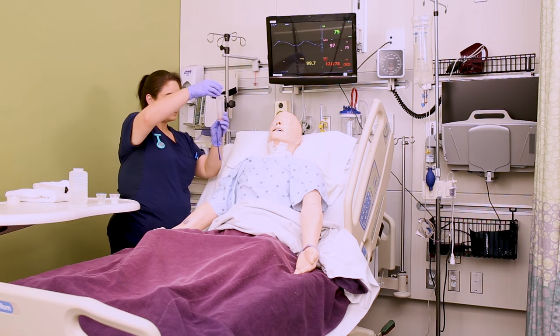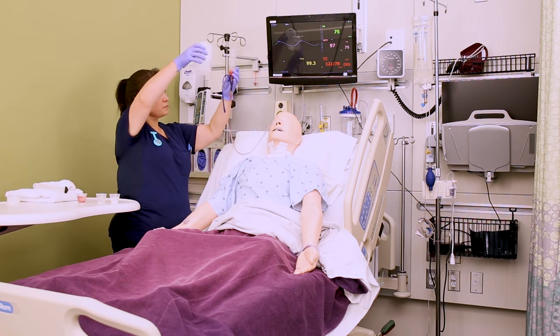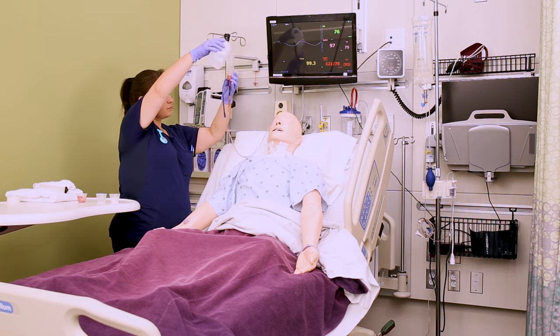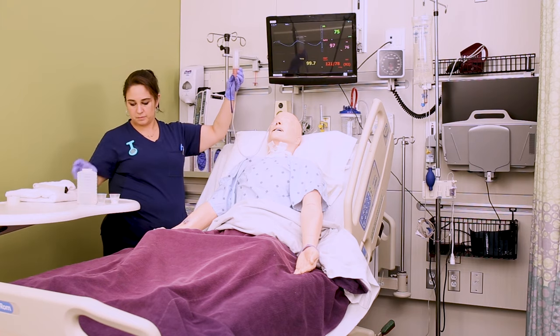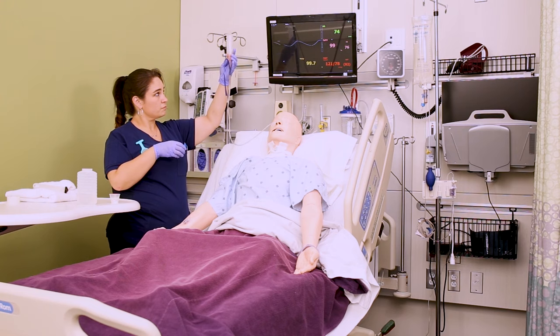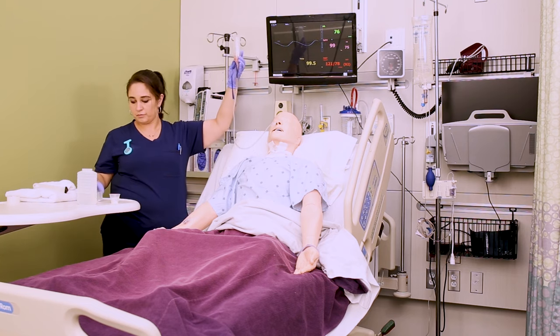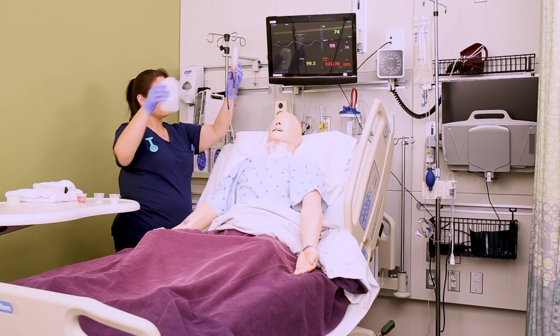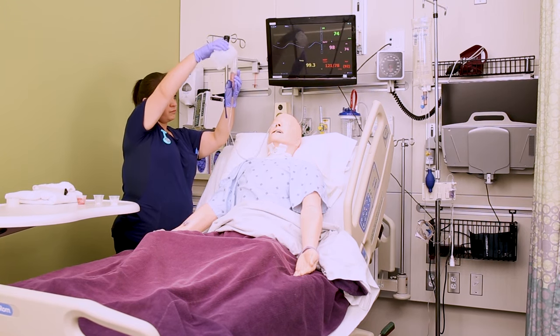Once that flush flows in, pour in the first medication and let it flow in by gravity. What I usually do is once the medication or flush gets to the bottom of the syringe, that's when I'll pour in the next thing — that way you don't have an entire tube of air going into the patient's stomach. Follow that with at least 10 mils of water between each medication to flush that med in, then give the second medication. Repeat that with every medication: give the medication, flush with 10 mils of water, give the next medication, flush with 10 mils of water, until you've done all the medications.